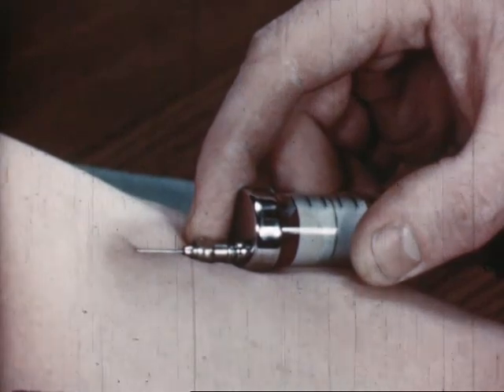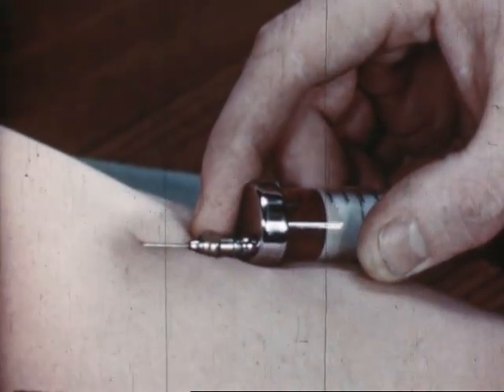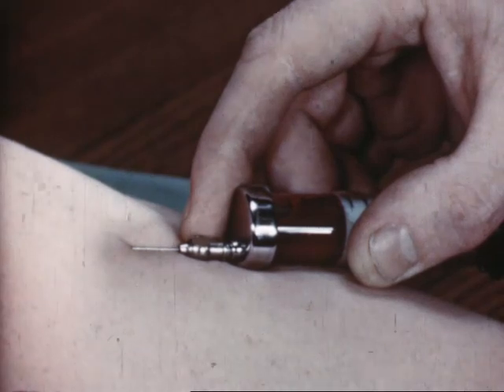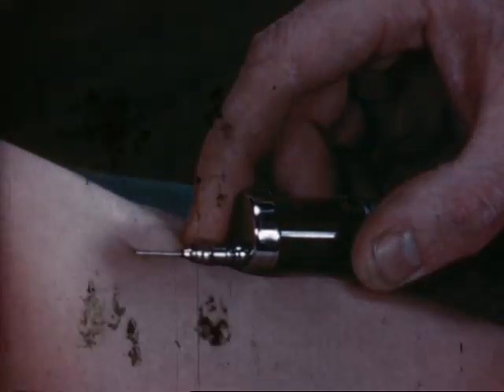Venipuncture is one of the most common procedures a doctor has to carry out in the course of his day's work. Patients don't like having venipunctures and are greatly relieved when they're done quickly and expertly. This film shows some of the faults that all too frequently occur and correct technique.